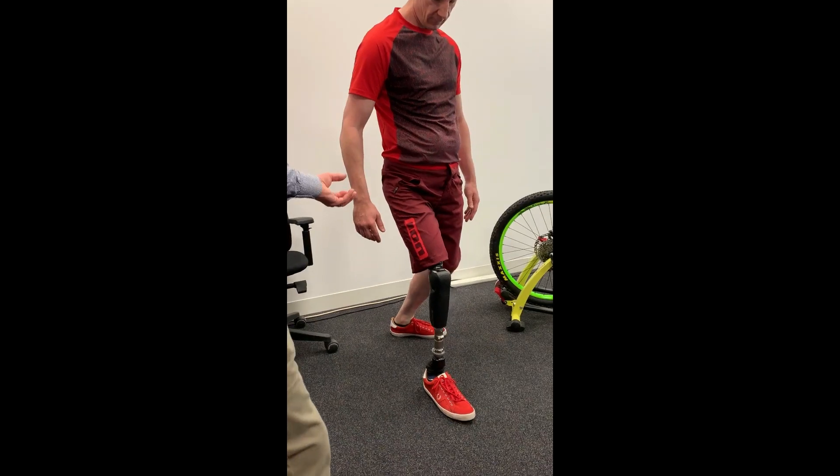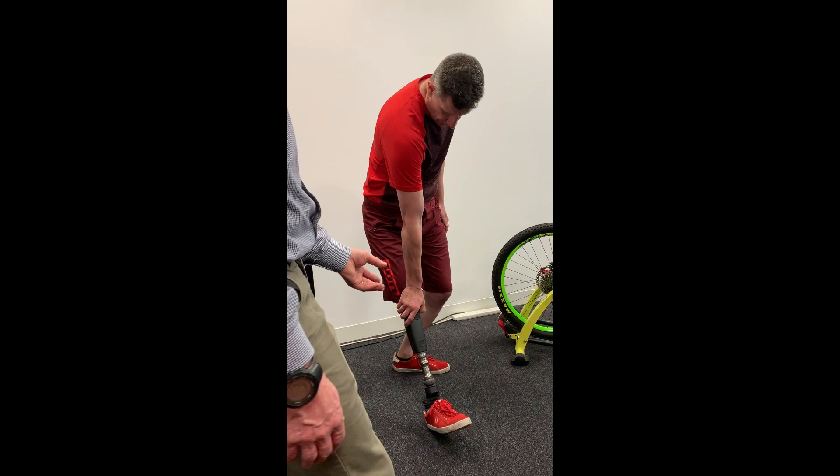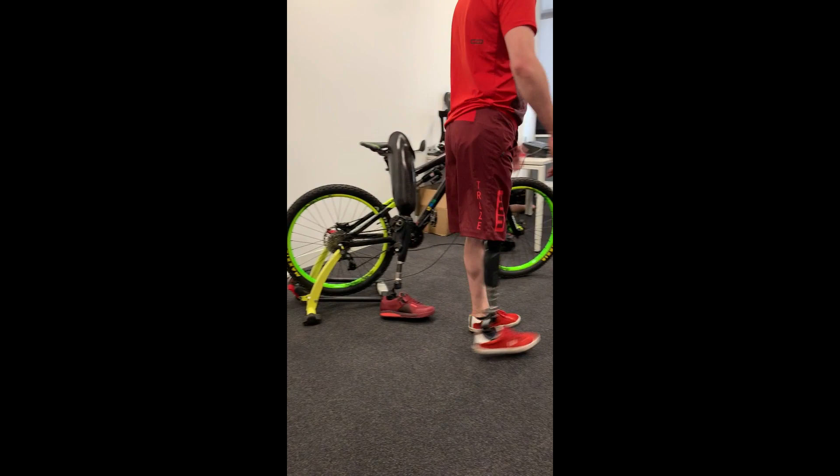Glen's sinking down. And will it lock as well if you stop? You can lock it that way. So there's a manual lock. Obviously I'm kind of like this now. So that's a safety feature.